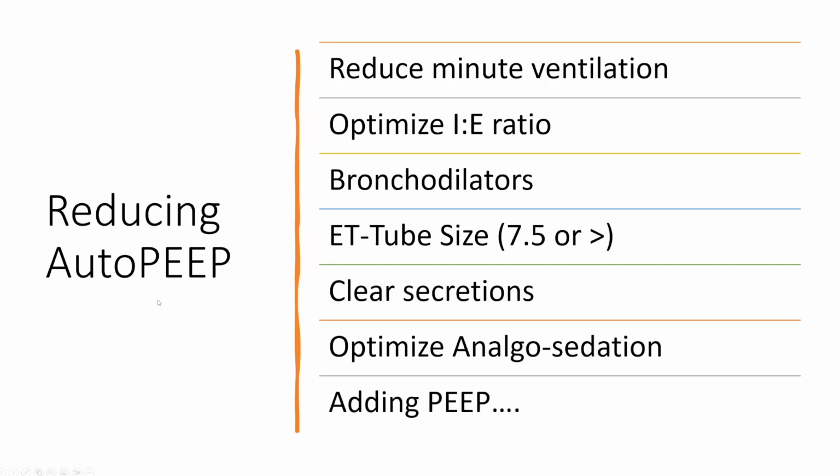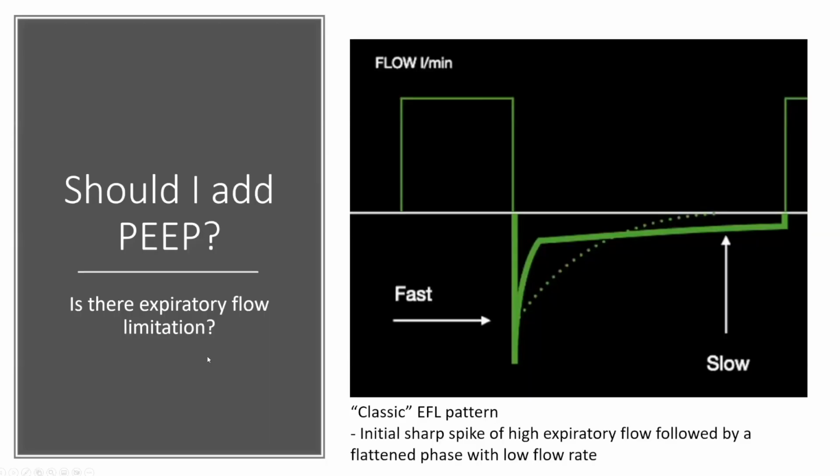Now, adding PEEP. This is one that we have to talk about, because it sounds counterintuitive initially. The concept of adding PEEP to mitigate auto-PEEP will automatically sound counterintuitive, and it can be controversial, but physiologically it does tend to make sense when you break it down.